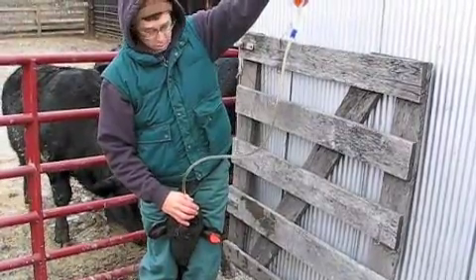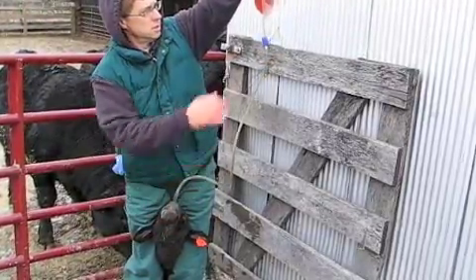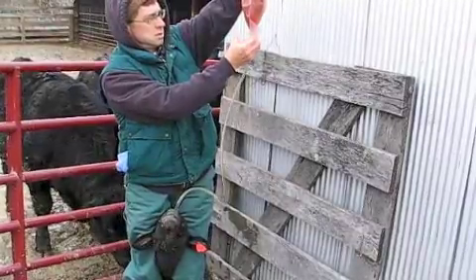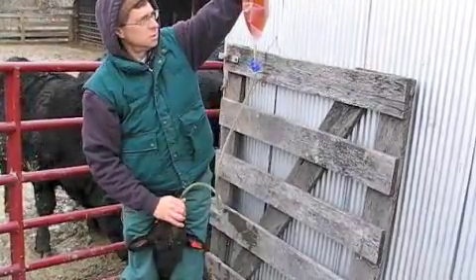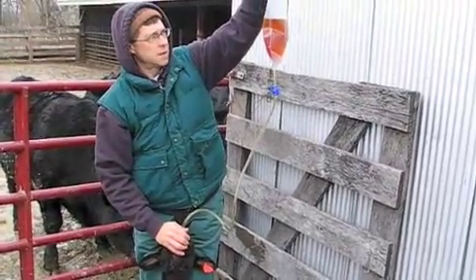Sometimes the calves will struggle a little bit right now — don't worry about it. If you've got it buried far enough, it's in the right place and you can't mess things up. This calf's doing really good; it's a little unusual how nice the calf's standing.